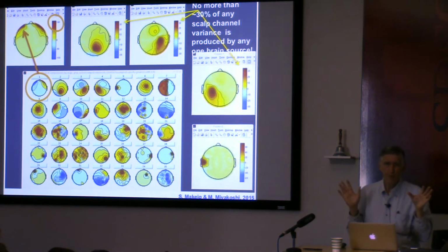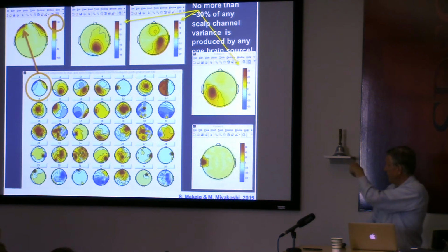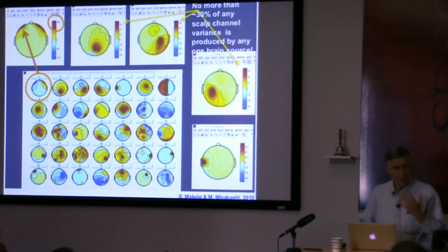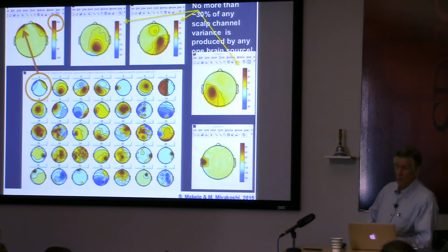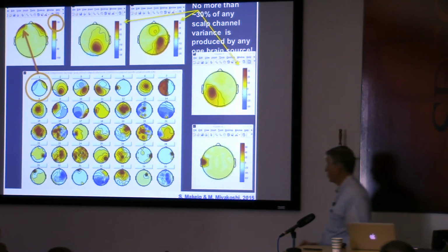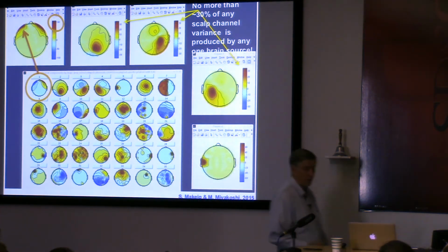Excuse my anthropomorphization. So I would tell the student, if this were a student, to try rejecting more messy data, that means non-stereotyped data, and the results would be better. These could not be associated with a single patch of cortex with a dipolar projection.